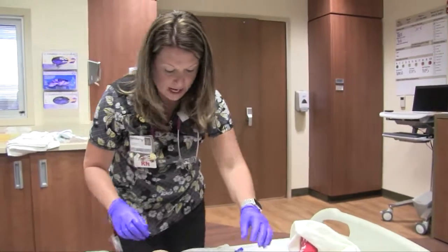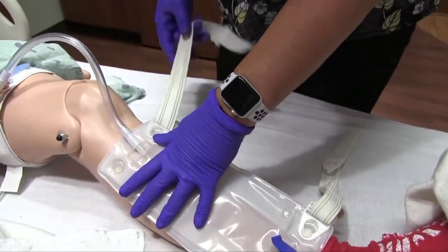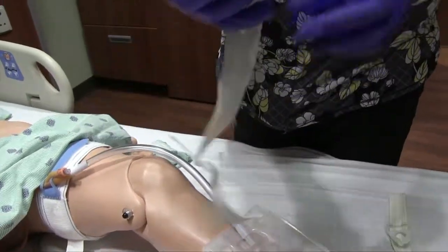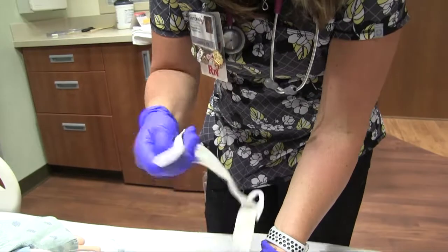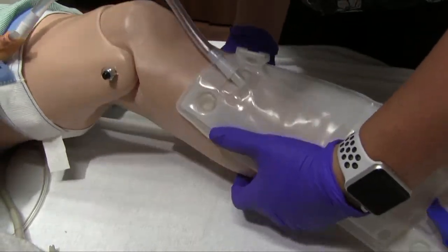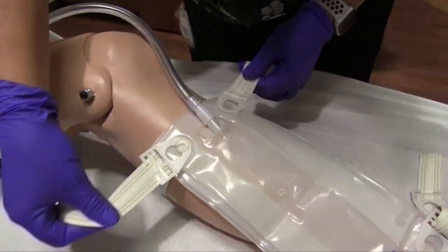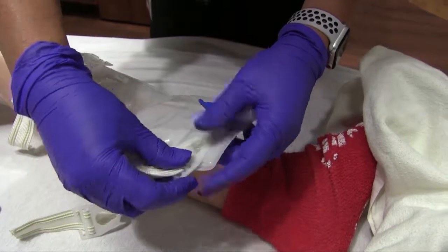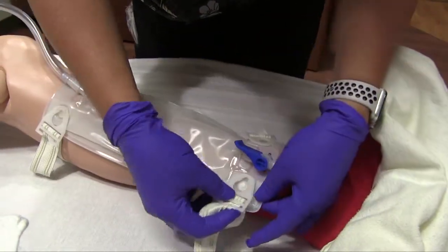So to secure your leg strap on the lower part of your leg, we have these straps here. There's elastic on this portion here, and that's the piece that you actually want against the skin so that it can grab the skin and secure itself. And you just slide this button in, just like so, wrap around the leg, secure the button, and cinch the ends for tightness, okay? You'll do the same thing down here at the bottom. Excuse me. Around. Cinch the ends for tightness.